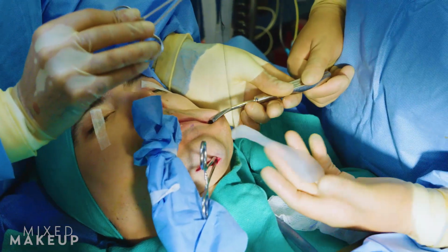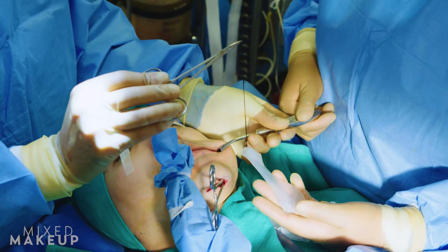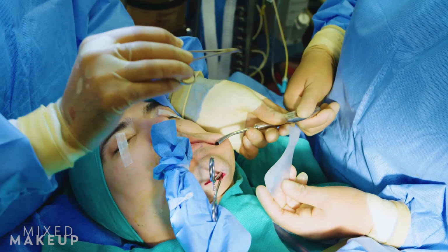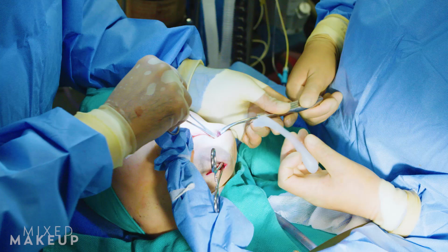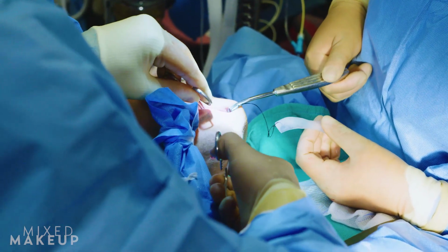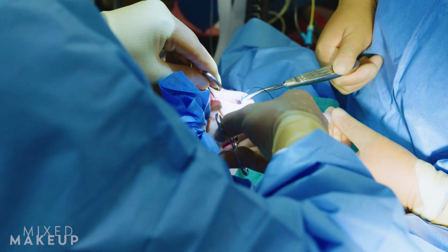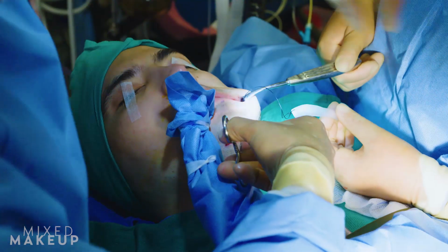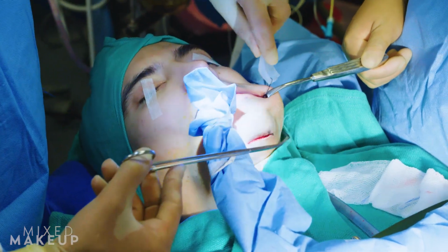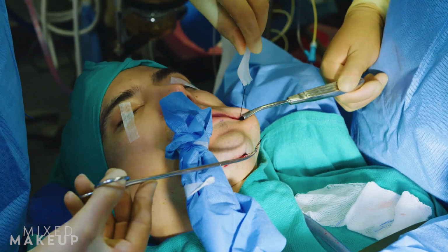So as you can see, I attached a suture to my implant. This is the left side. By attaching that, I'm able to use this guide wire or guide thread into the incision site. Can you just pull on it, keep it taut, please? And what I use is this other instrument to grab it. And now we're able to feed it through and pass it along the jawline, as you can see.